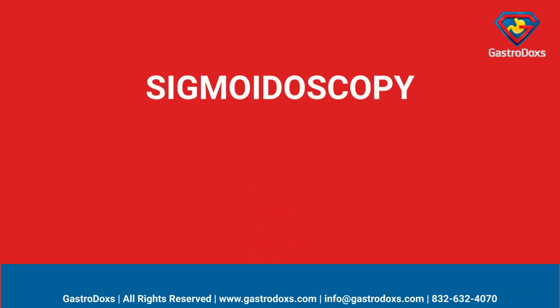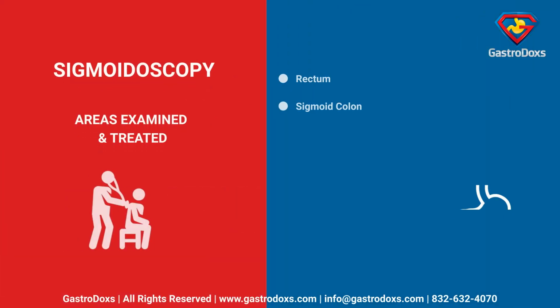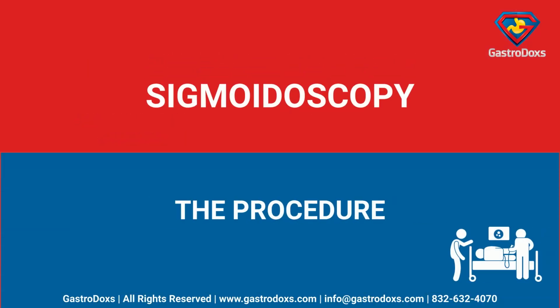Sigmoidoscopy. Areas examined and treated: rectum, sigmoid colon. The procedure.